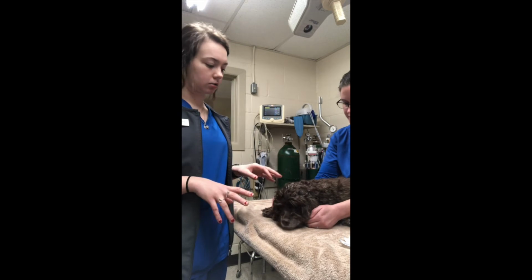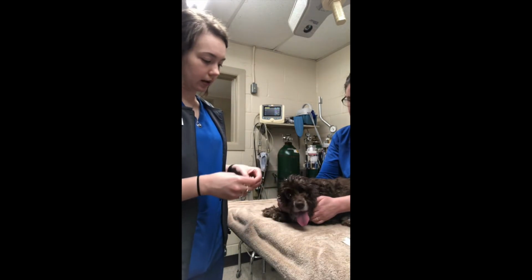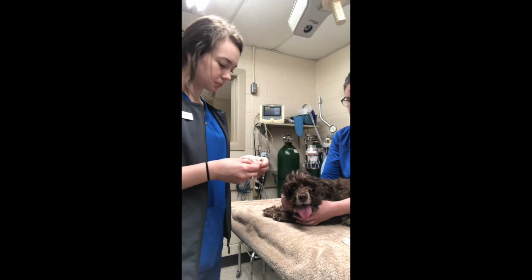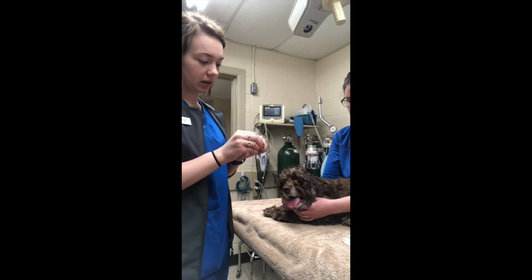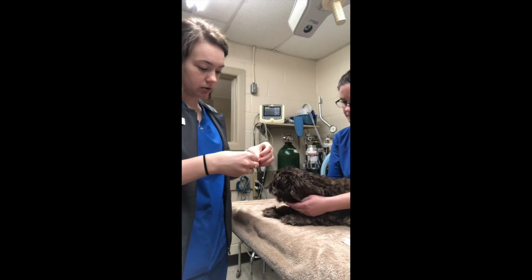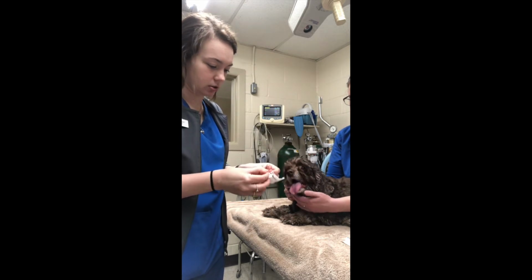Okay, I'm going to do the ocular testing. The first test I'm going to do is the Schirmer tear test. So I'm going to make sure that this patient has not had any eye medication administered within 2 hours before this test. So I'm going to get sterile Schirmer strips, and I'm going to bend these rounded in about 90 degrees before I open the package. And I'm going to open it from the opposite end of where it's bent to make sure it stays sterile.